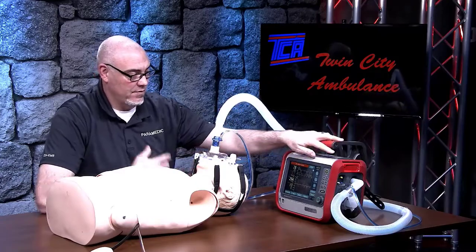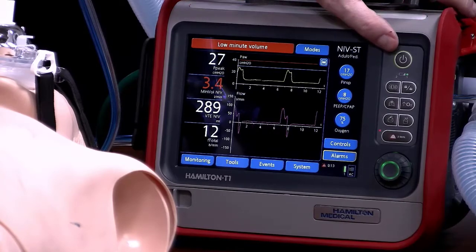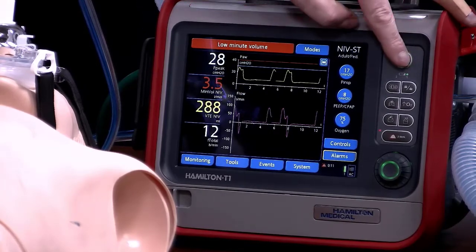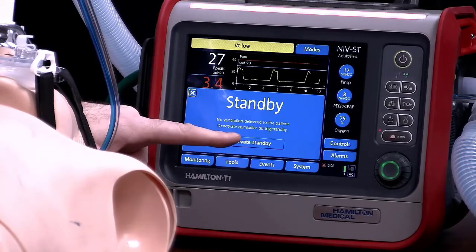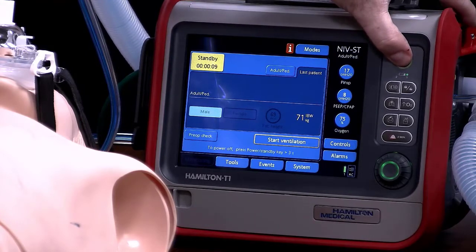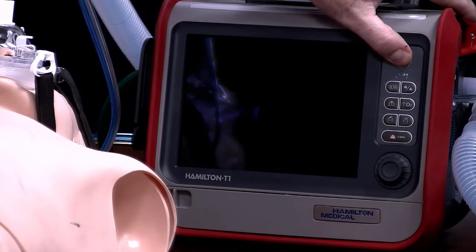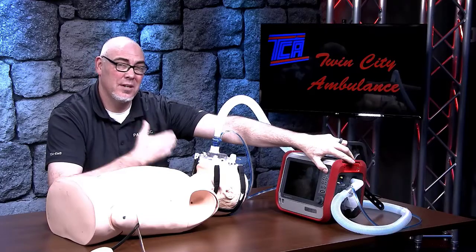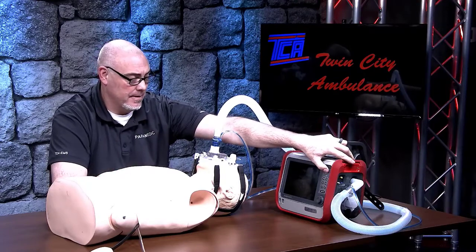For shutdown: when you've gotten to the hospital and transferred the patient over, hit the power button. The power button is going to bring up the standby menu and ask you to activate standby — click and do that. Once you're in standby mode you can change modes and do setting changes. If you then hold the power button, that will turn the ventilator off. The ventilator cannot be accidentally shut off with one push of the power button — you have to first put it into standby mode and then turn it off by holding the button down.